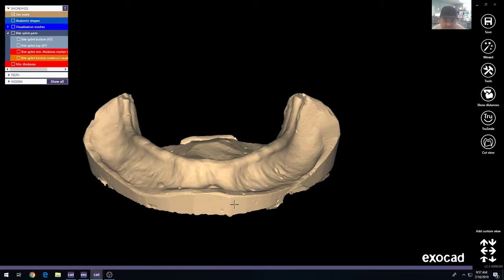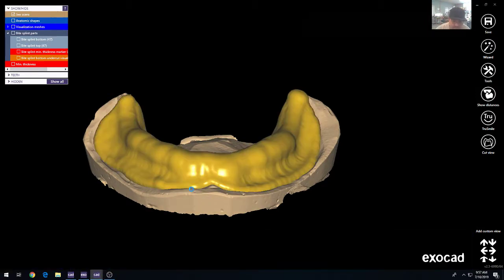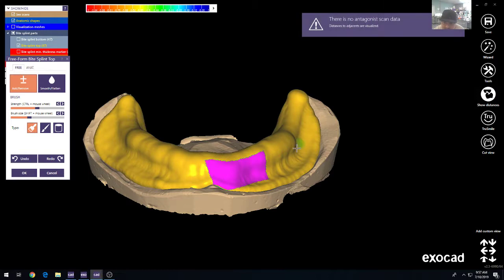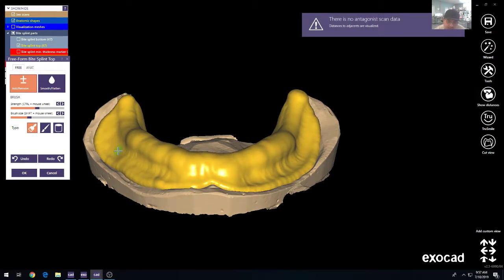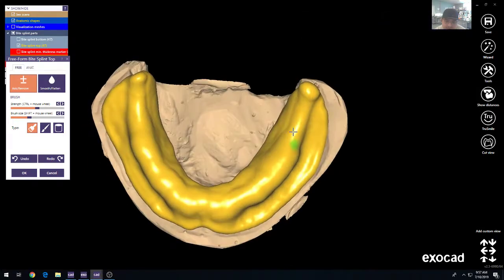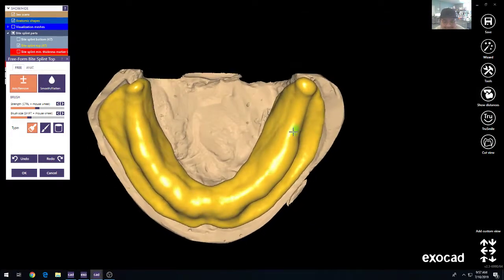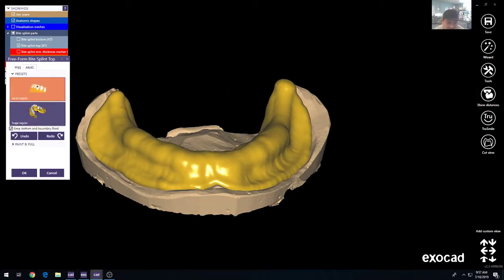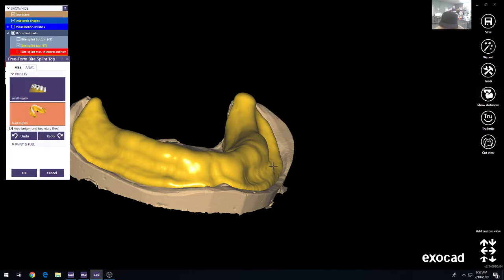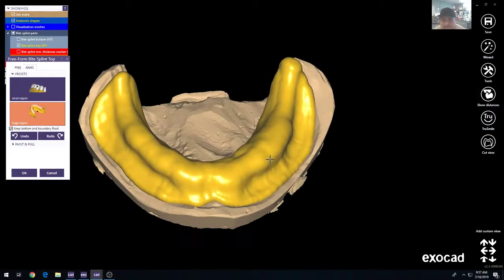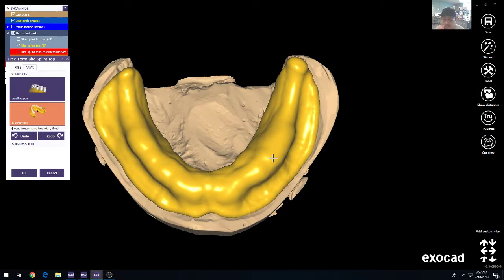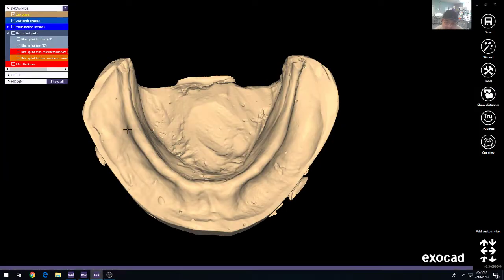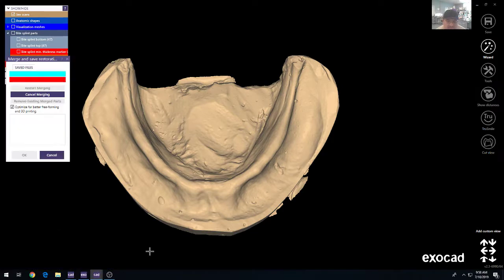The next step in the process would then be to freeform anything that you didn't like in the design. Basically, then what we could do is use the anatomic selections if you wanted to bulk this out or thin it out. This is going to be for a wax rim that we're going to put on afterwards. So basically what we'll do is just leave it like so. And then the only other step is to then merge and save your restoration.